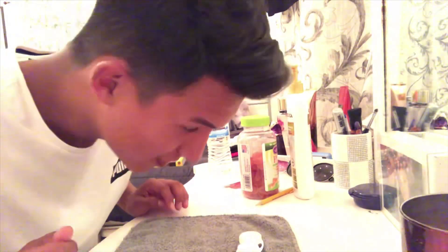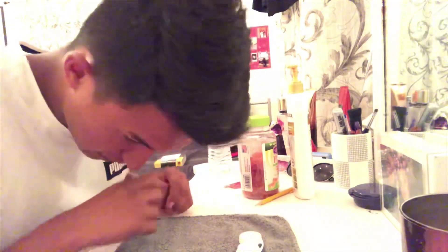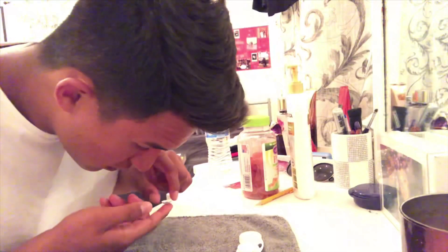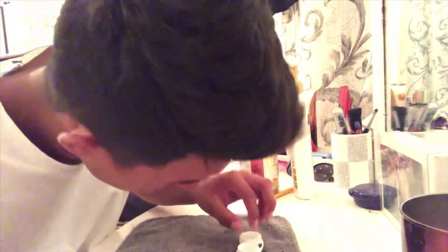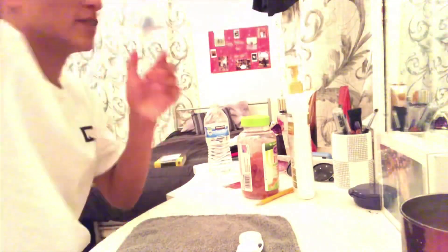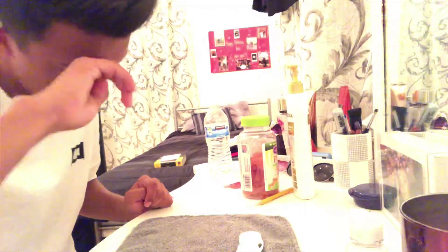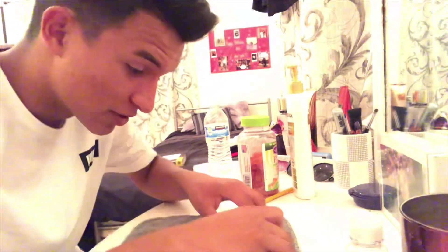Got it — right here. It's not water, it's usually the liquid for the contacts. I usually pour a small amount. All right, so next one is the left one — make sure I close this one already.